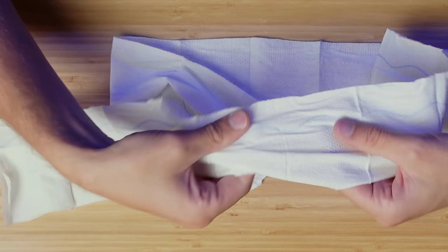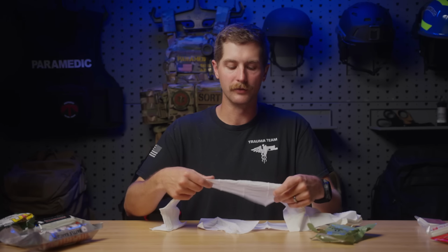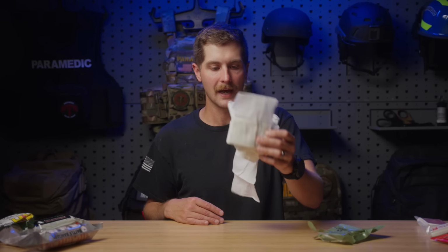You're going to notice a strip in the middle, and this is a radio opaque line that is meant to show this gauze on any kind of radiograph. So if you're doing a CT scan, an X-ray, that surgeon's going to see this gauze and they can make sure that they get everything out of that wound so the patient doesn't get more massively infected than they already are and develop an abscess and all kinds of nastiness.